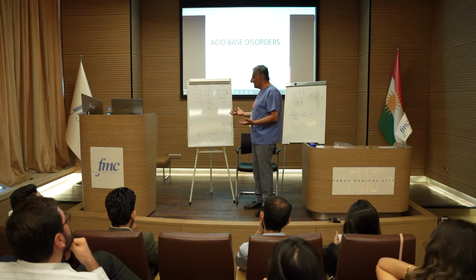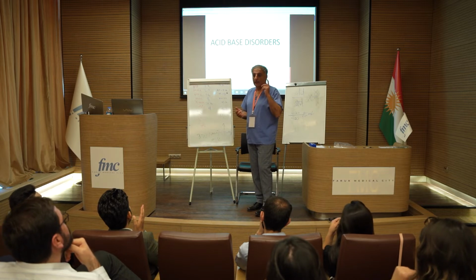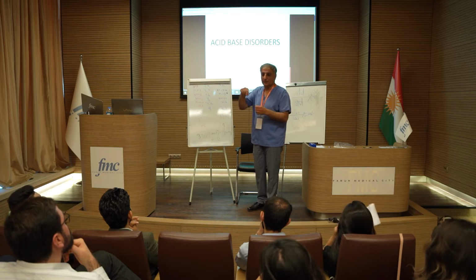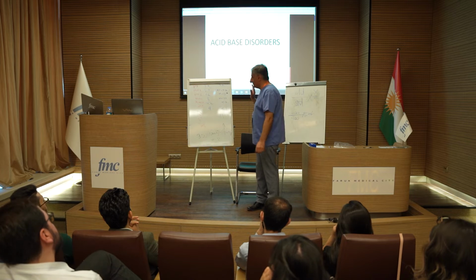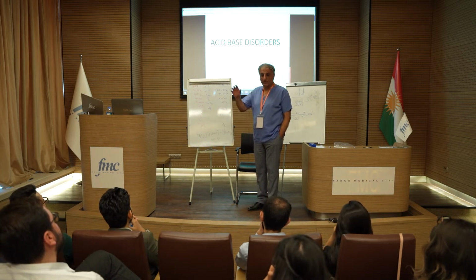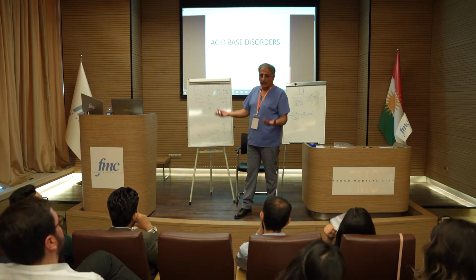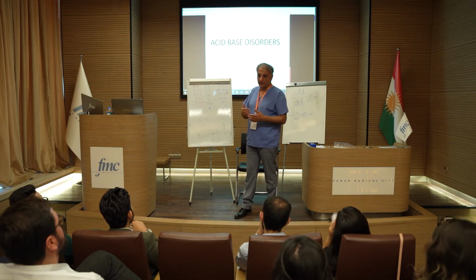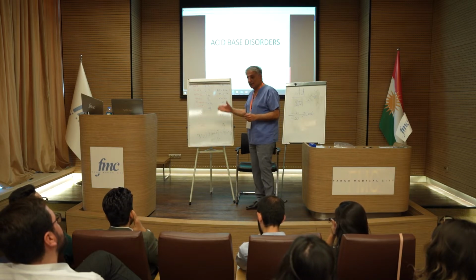So what does this picture suggest? It suggests metabolic acidosis. It doesn't suggest ketoacidosis because we don't know where the acid comes from. Now, if we take it further and do the blood sugar, the ketone is high. So we establish a ketoacidosis in this girl who missed her insulin. Why is lactate high?